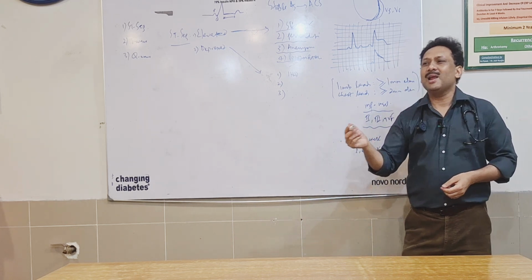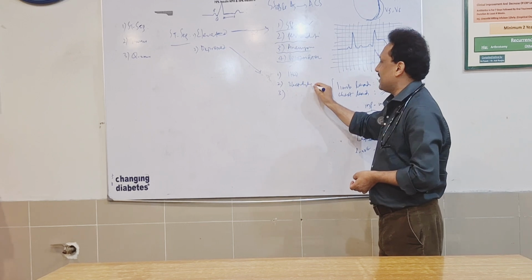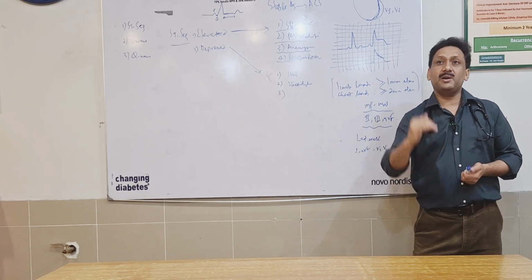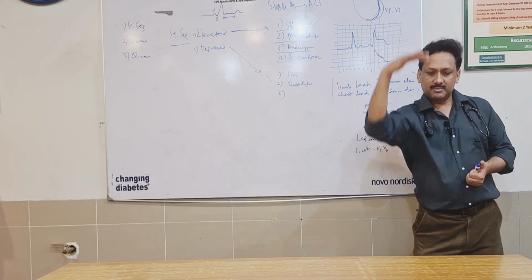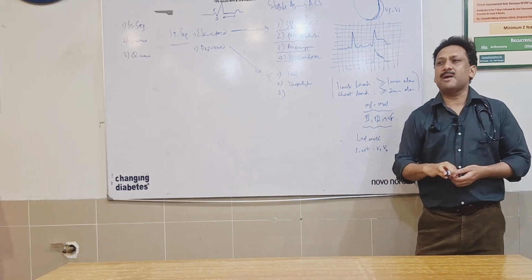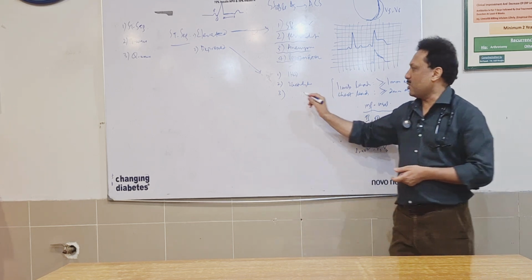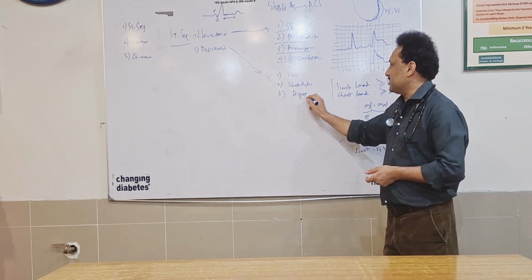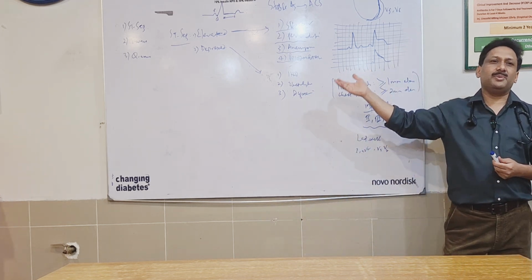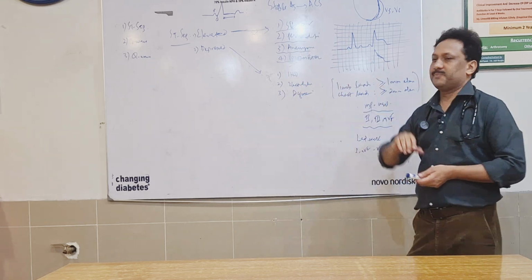In the setting of certain electrolyte imbalances, like hypokalemia, the T wave gets depressed and ST gets depressed to some extent. Hypomagnesemia, hypokalemia, and digoxin toxicity can sometimes lead to the same kind of picture. So you may see depression in these situations. These are the total differentials.